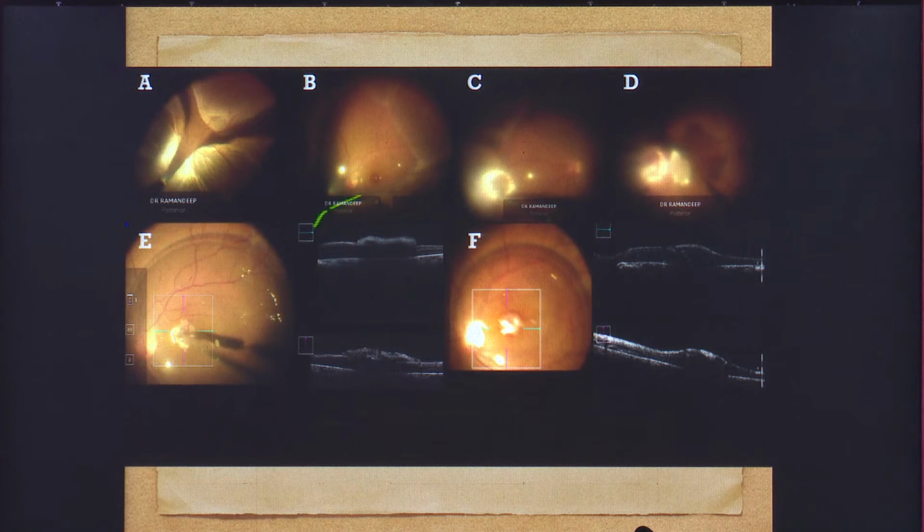And this is how you can also follow up these patients post-op, to see whether your tuck is incomplete, whether your sensory retina was smaller or bigger. You don't want it to be too small or too big. Ideally, people are still working on how much, 25% more or 55%. This is just like the optical graft, where we have to decide whether we take a 7.5 or 7.25.